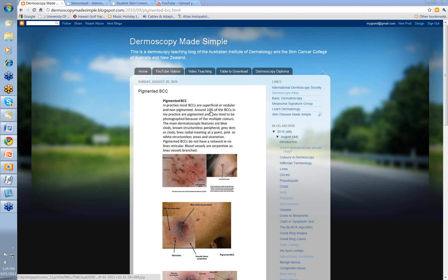I reckon I see about 10% of the BCCs in my practice as pigmented BCCs. I certainly see a lot of superficial BCCs because of the solar damage we get here in Australia. Most pigmented BCCs are photographed because they look good — they've got multiple colors and they photograph well.